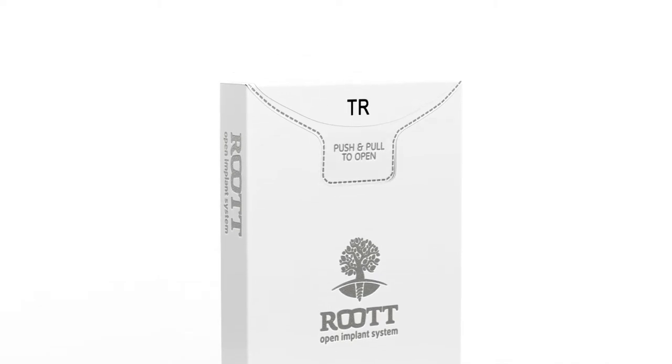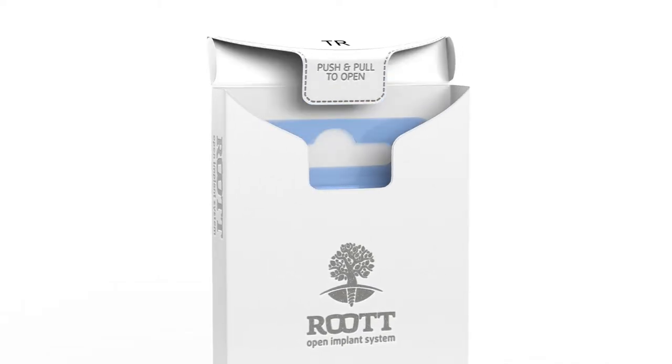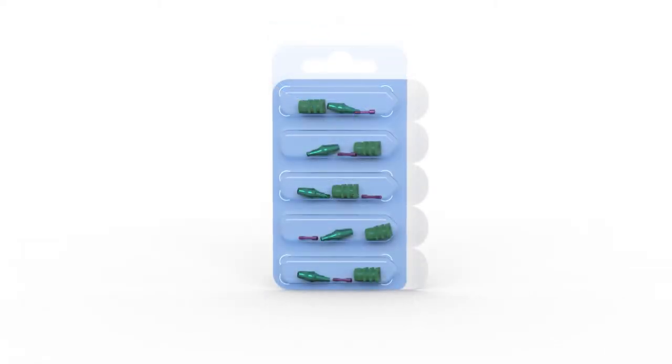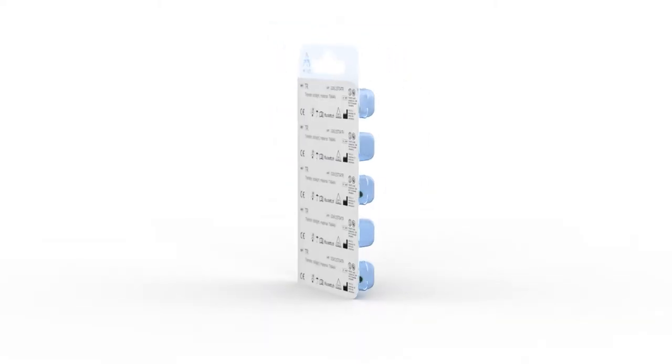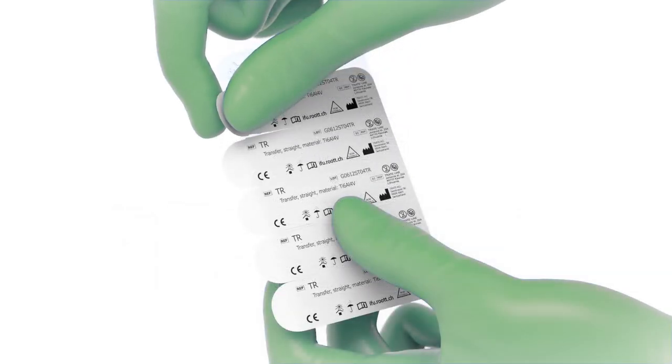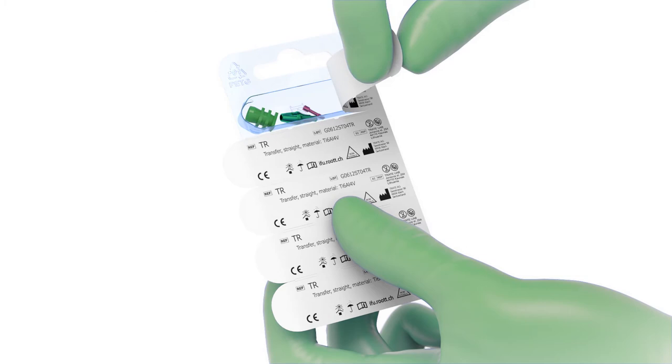Open the box and open the blister. Sterilize products before use.